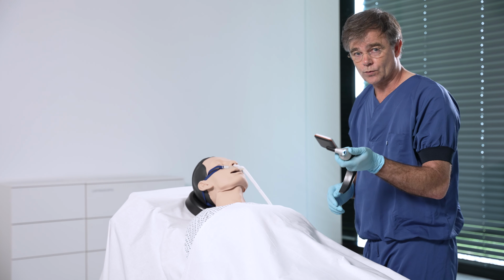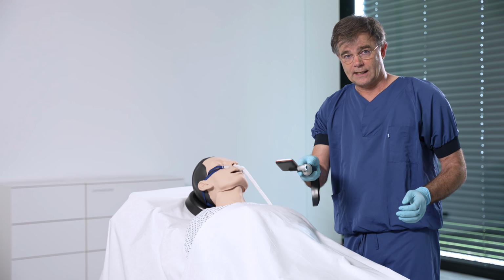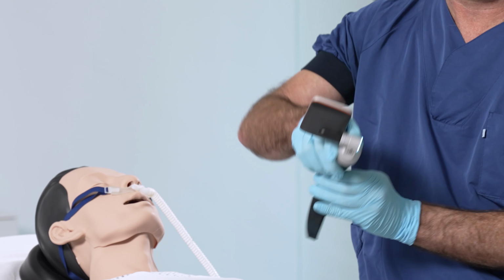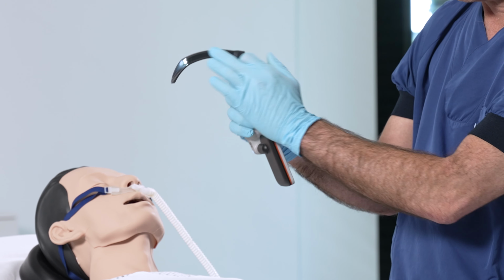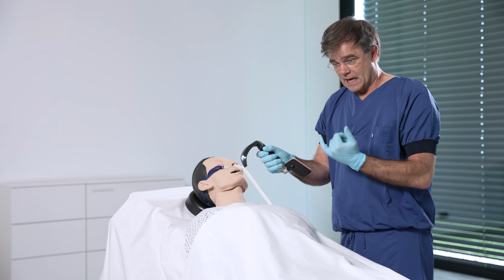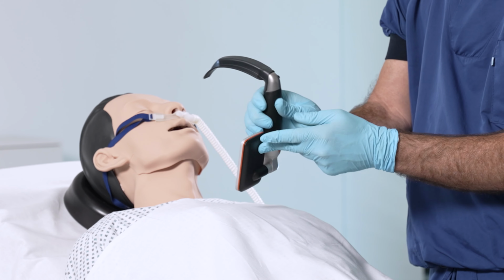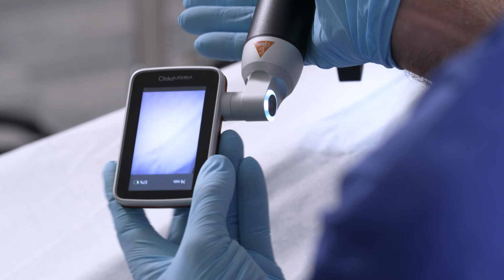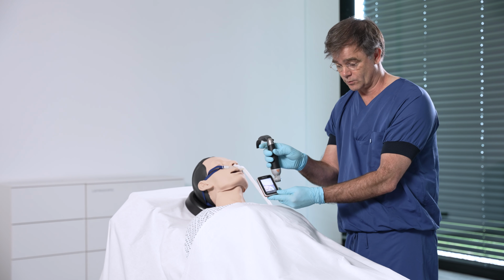And I don't hold the laryngoscope in my left hand, no, I hold it in my right hand. And there's something else we do, we flip it. So I hold it upside down. And if you look carefully, this looks like a Tomahawk. So this is the idea. And the good thing with this video laryngoscope is this screen is very mobile. I can turn it in all directions, and this is very practical if you do a face-to-face intubation.